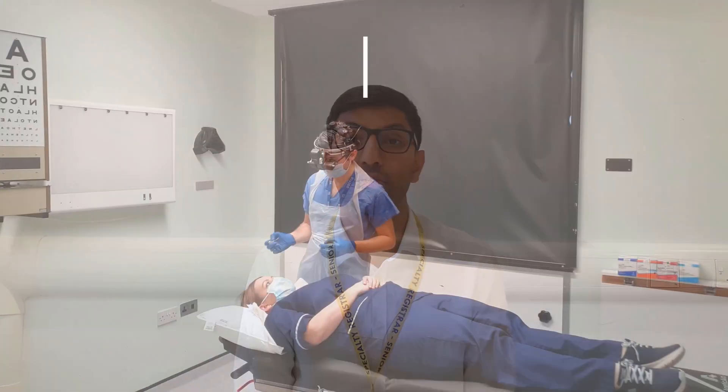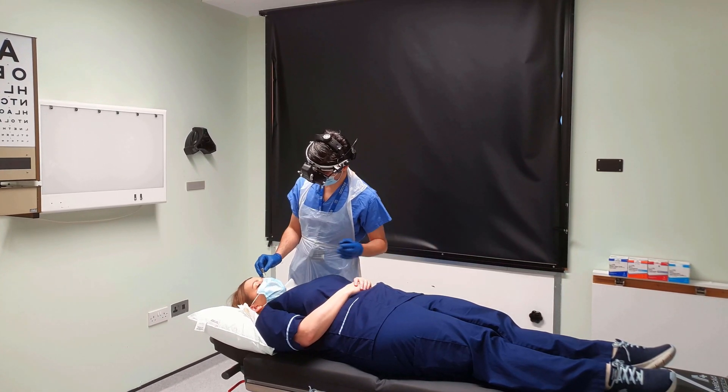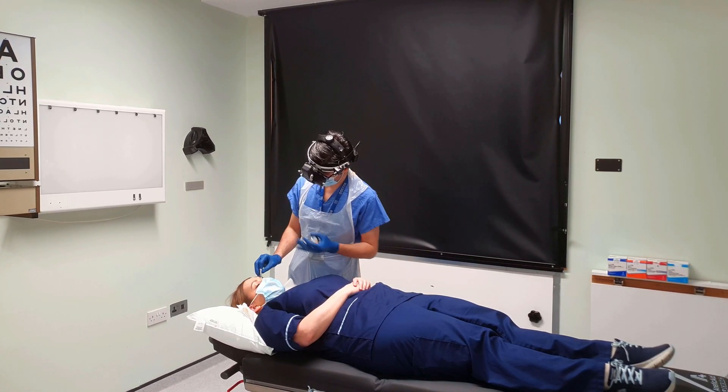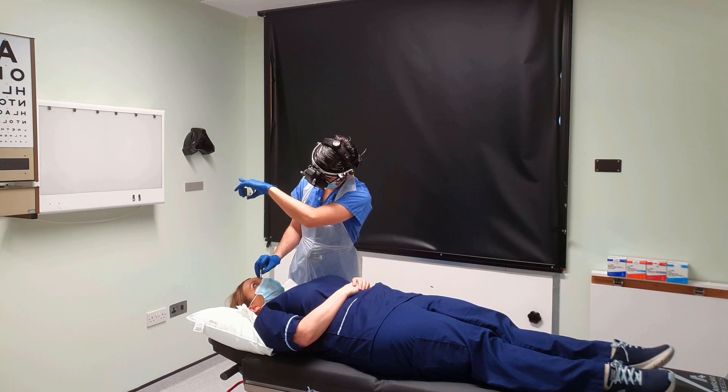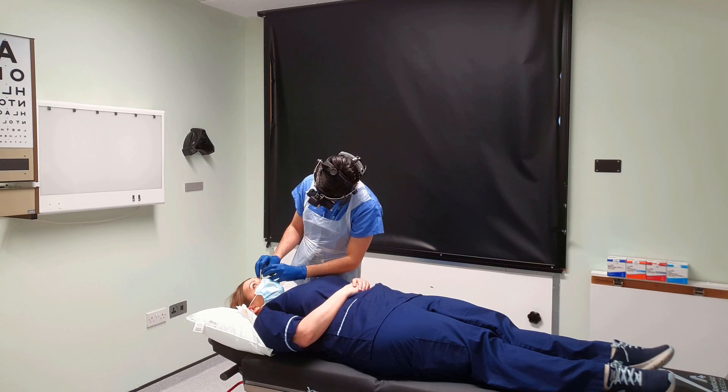To perform scleral indentation, position the patient as before. You can indent directly onto the sclera or over the eyelids. Ask the patient to look in the opposite area to be examined. Allow the indenter to rest tangentially against the area to be indented, then ask the patient to look towards the area to be examined and exert a gentle pressure.